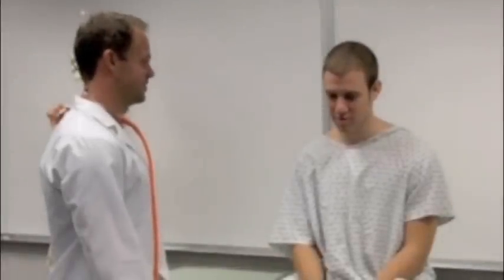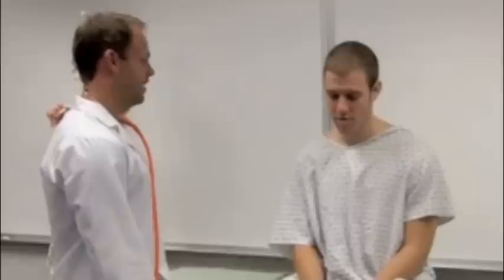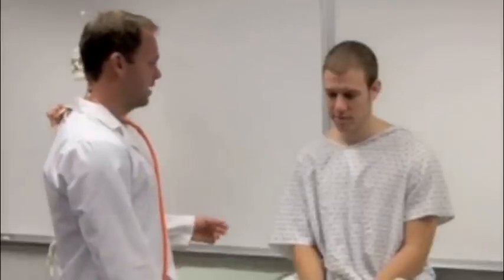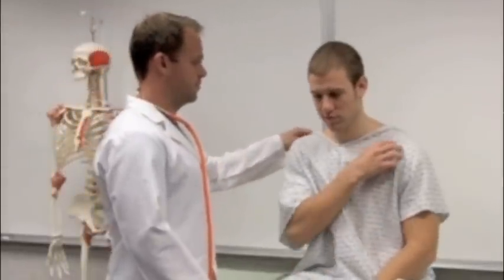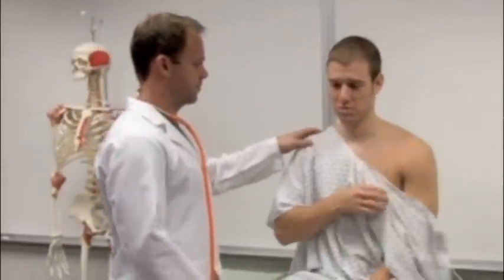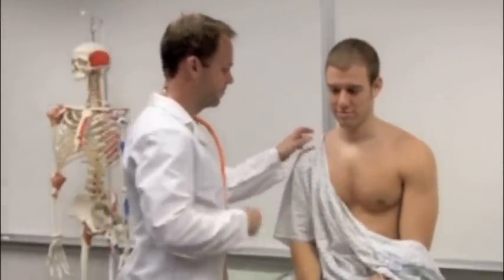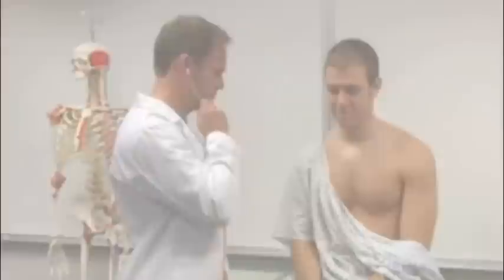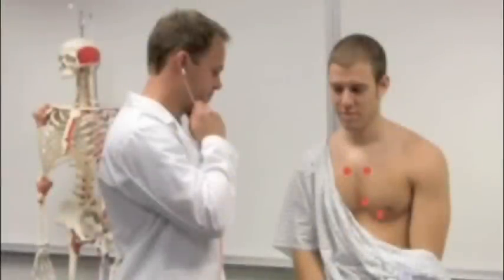Heart auscultation is performed to assess the rate, rhythm, valve function, and anatomical defects of the heart. Four areas of the heart are examined using the diaphragm of the stethoscope. These areas are shown here in red.